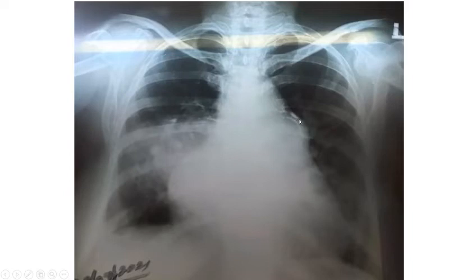Nowadays it's very difficult to see this type of calcification. But when you see two parallel lines, then you should think of the possibility of a calcified ductus. And the patient has got huge right pulmonary artery, end-on arteries, but there is peripheral cutoff. All these indicate the patient most likely has PDA with Eisenmenger.